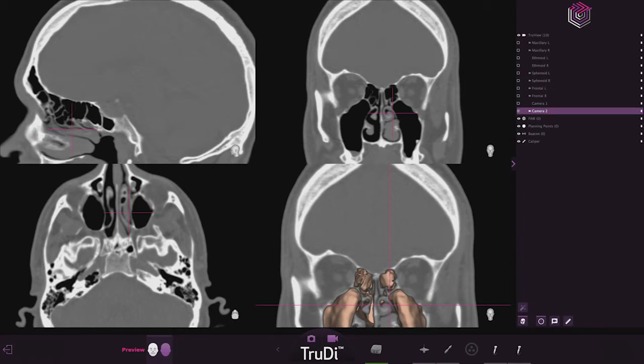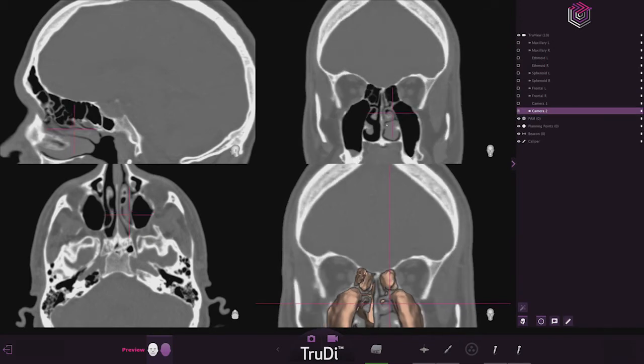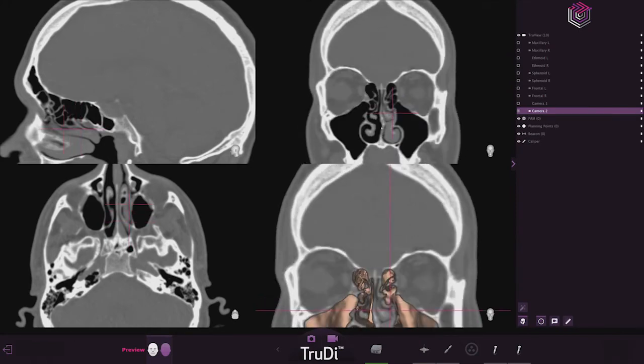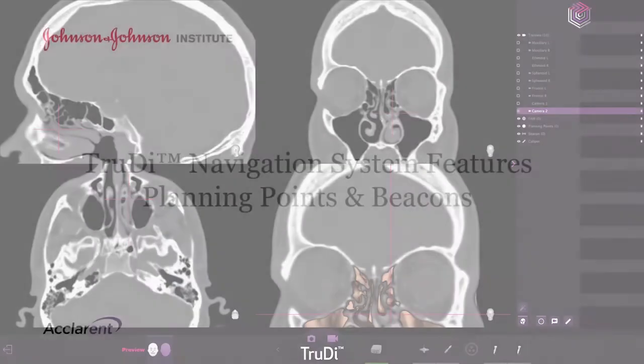And so what we're seeing here now isn't so much a state of chronic sinus inflammatory change, but this is a patient with recurrent acute sinusitis, and so we're going to go ahead and plan to treat whatever sinus we can.